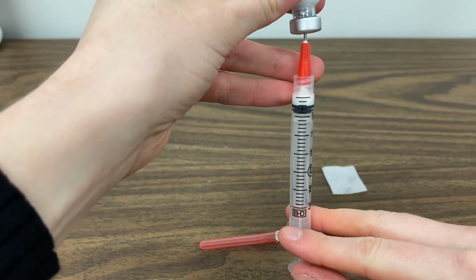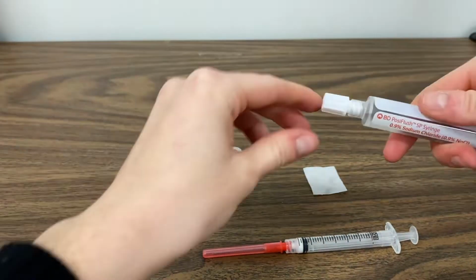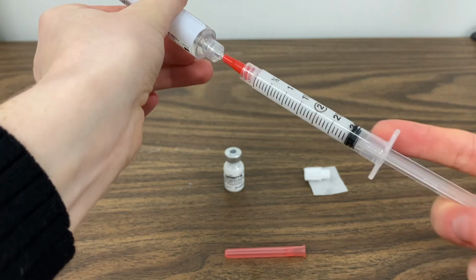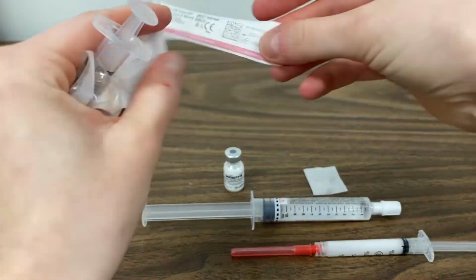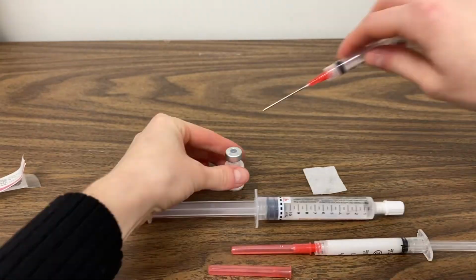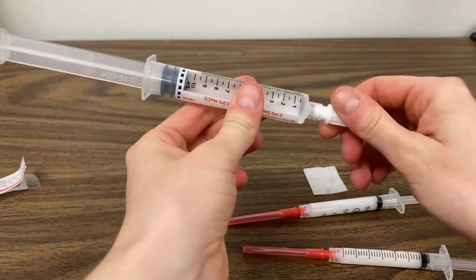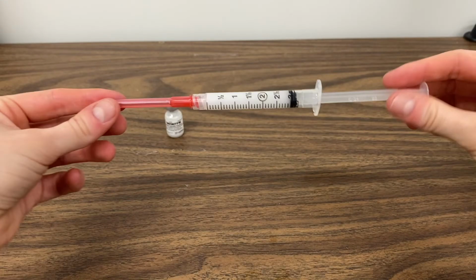So here I am diluting 0.2 milliliters of Definity in 2.8 milliliters of saline in a 3 milliliter syringe, and repeating the exact same step for the other side. I will administer 1 full syringe to image one side of the neck's carotid arteries, followed by a flush of the line with 2 to 3 milliliters of saline, then usually will administer the second syringe when imaging the other side. If the participant already has contrast in their system, or the images look very bright and clear on the second side, you may only administer 1 or 1.5 syringes.